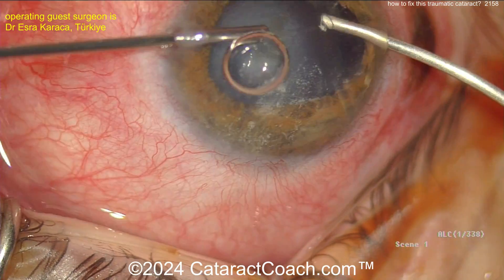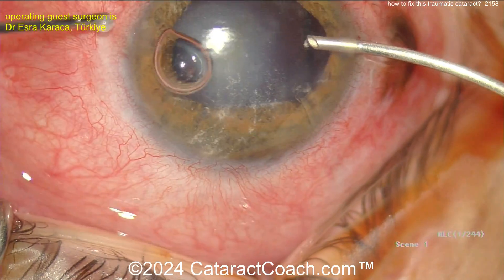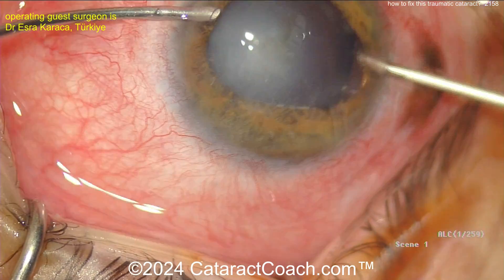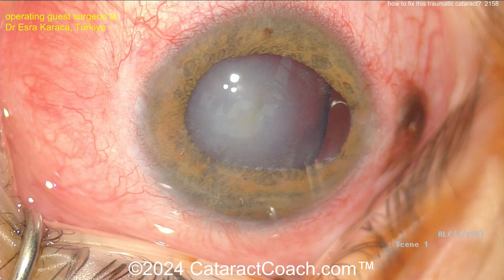A little triamcinolone can help to stain that vitreous that's prolapsed. And now do a 23-gauge bimanual anterior vitrectomy. When you do this, you may need to restain the vitreous with triamcinolone. Make sure you get it all out here and be careful. Don't damage that lens capsule — it can be very delicate.